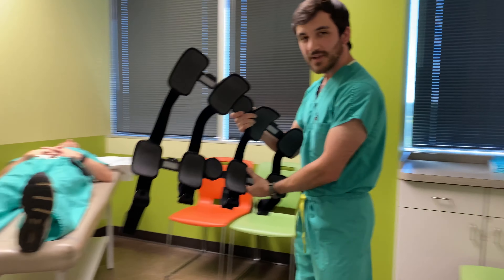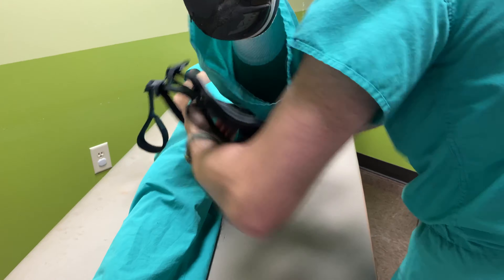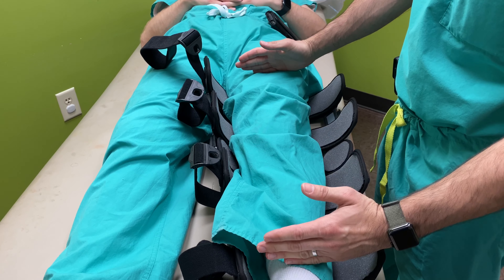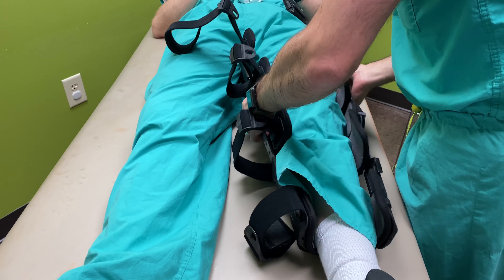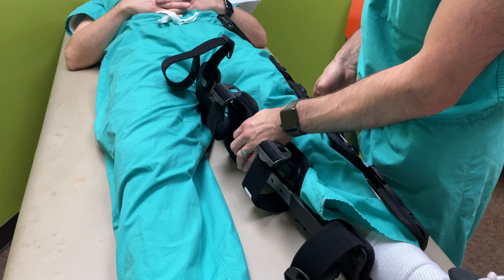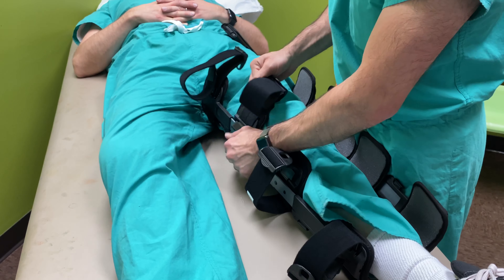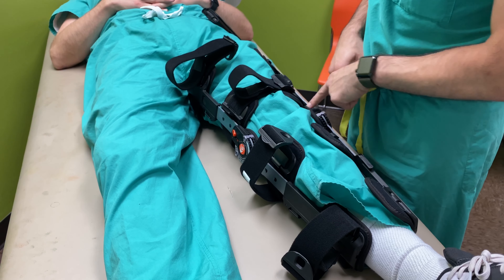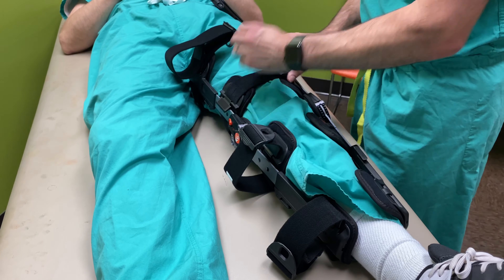Now let's take a look at how to put it on. We've got Dr. Pendleton, one of our sports medicine surgeons, to serve as an example. First, we make sure it goes mid-thigh to just above the ankles. These circular pads should be right at the point where the knee joint bends. I'm going to adjust it just about an inch or so. I think it's easier to put the brace on when it's locked straight at zero degrees, but depending upon your range of motion, that might not be possible. I'll connect this clip for the strap just above the knee. You can see when I did that, it kept the pads away from the sides and started angling them forward — that's something we want to adjust.